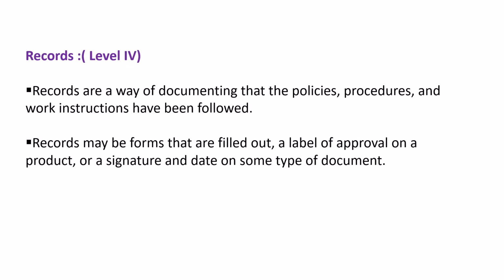Last level, that is record. Records are a way of documenting that the policy, procedures and work instructions have been followed. Records may be forms that are filled out, a label of approval on a product, or a signature and date on some type of document.